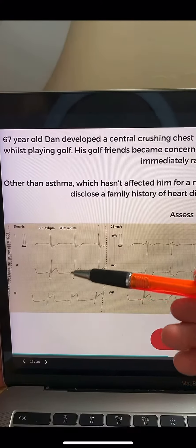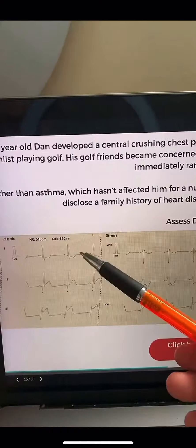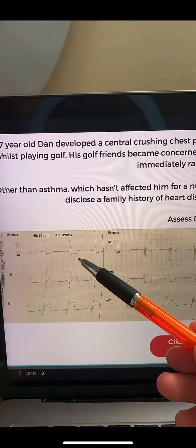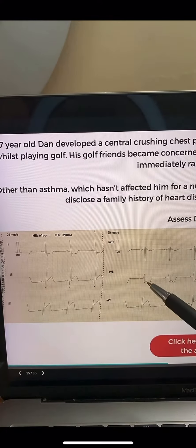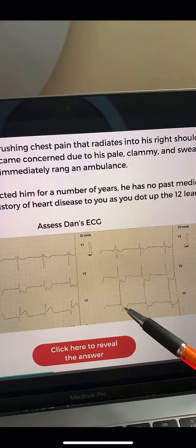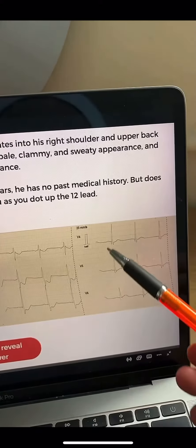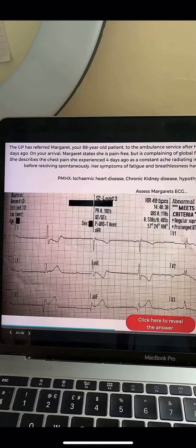Here's some ST elevation in the inferior leads, and here's some reciprocal ST depression in lead 1, lead AVL, lead V2, V3, and V4. These are reciprocal changes.